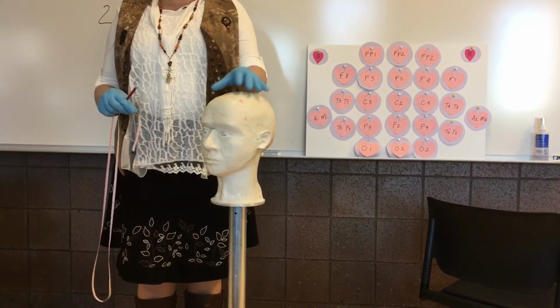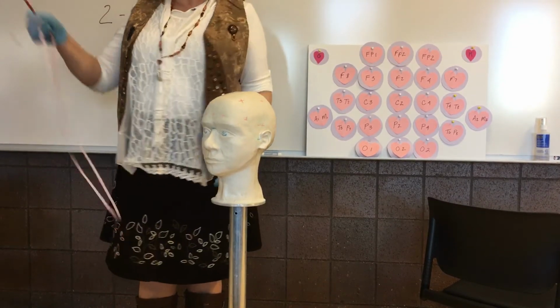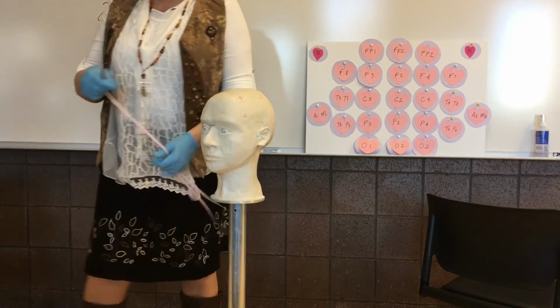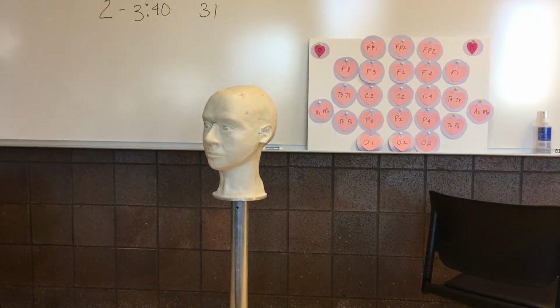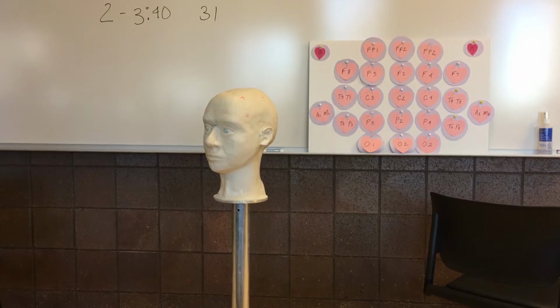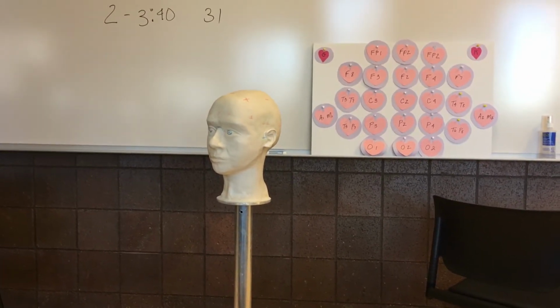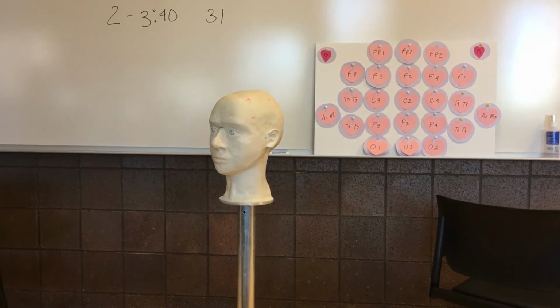I don't want to take the time to measure each deviance and document it, but you'll have time to do it in lab. You can print as many of these sheets as you want. You can measure the head, then check your measurements and document them, and look and see if you have any problem areas. You can maybe mark it on this little head diagram.